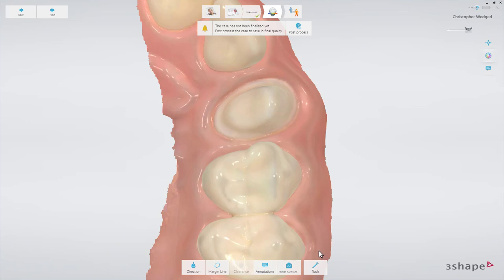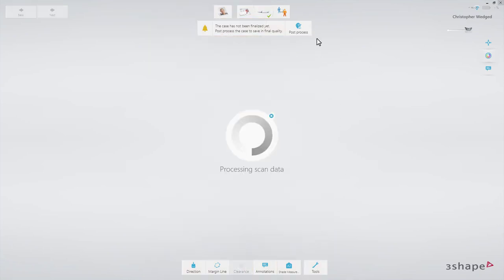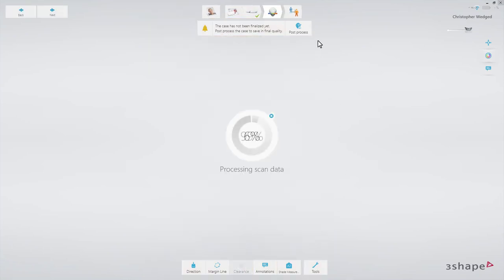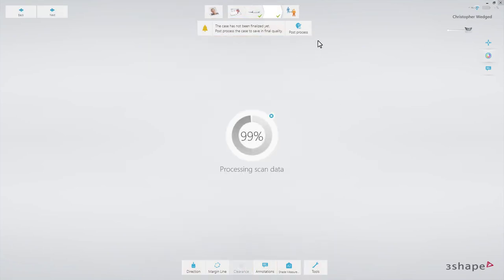Then press the post-process button. Finally, take another snapshot. Select the tools menu and choose the snapshot button.